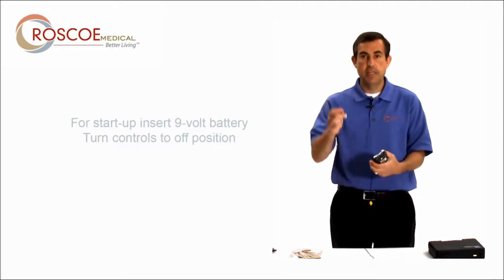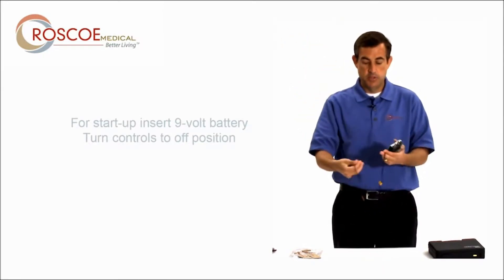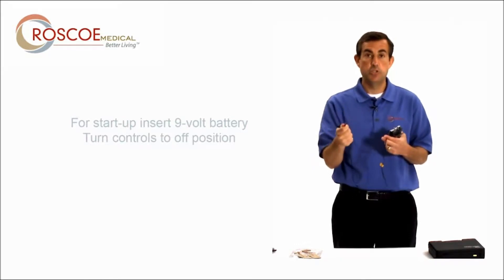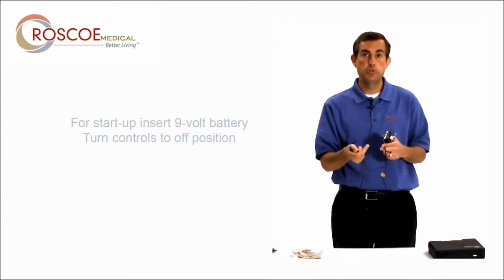The next thing you do is take out one of your lead wires. You get two of these, so one lead wire goes to two electrodes. If you want a two-electrode setup, you just use one lead wire. If you want a four-electrode setup, you use two lead wires.